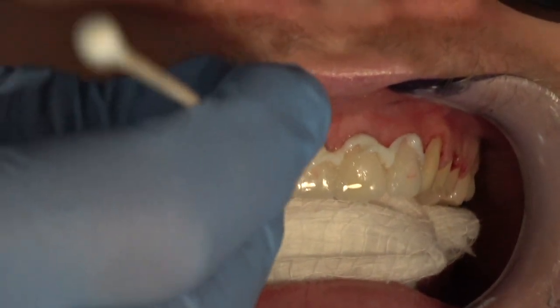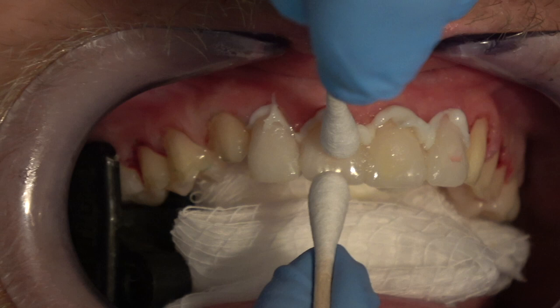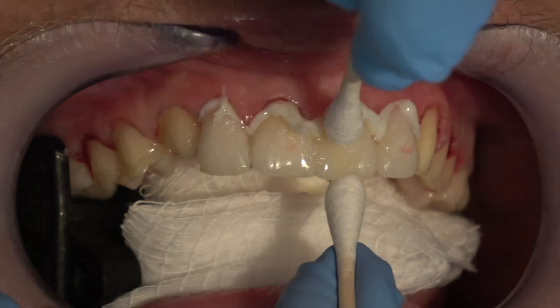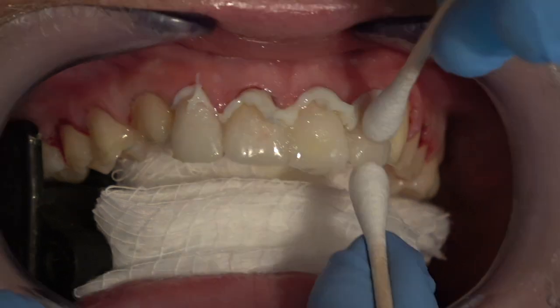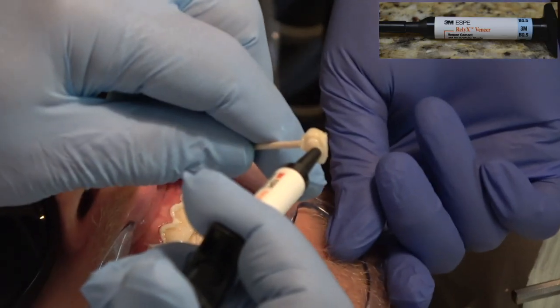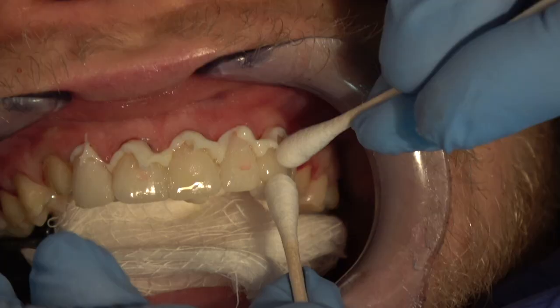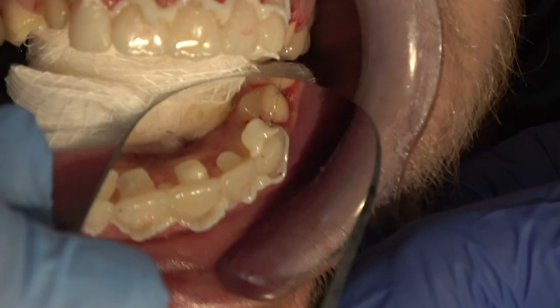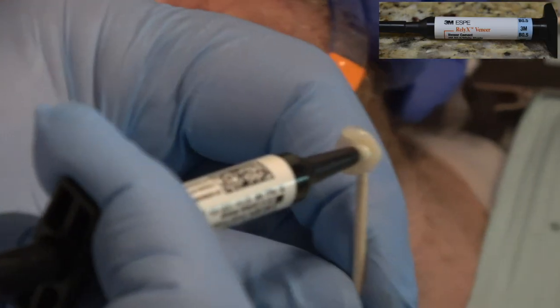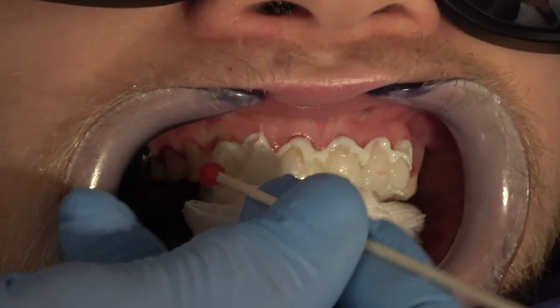Put them into place, and this is two cotton tip applicators, just being sure that everything's aligned. Check them from the incisal edge, incisal plane. You've already tried them in, so you know they fit. And I go back each time. You don't have any hurry because they're not going to cure until you cure them with the curing light. They're not going to set up. So you've got all the time in the world to go back and push them to place, be sure everything fits. I'm checking to be sure that they're completely seated.